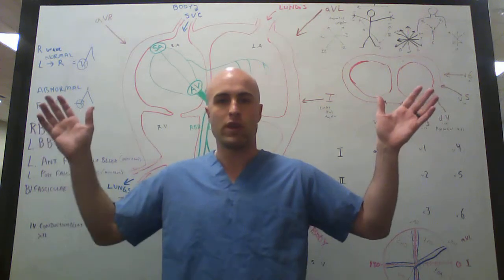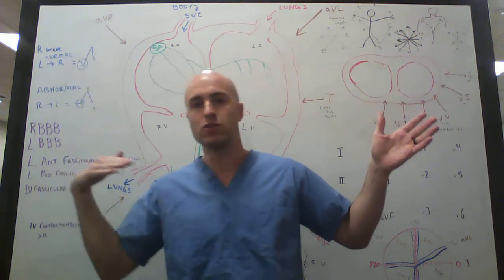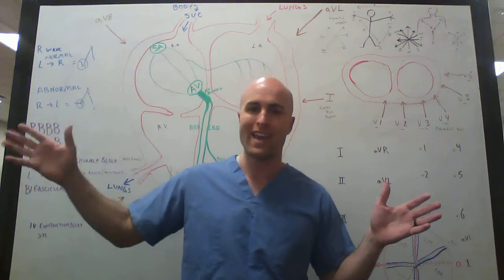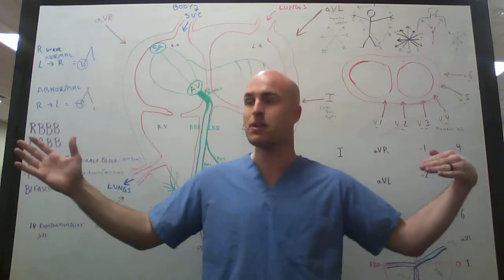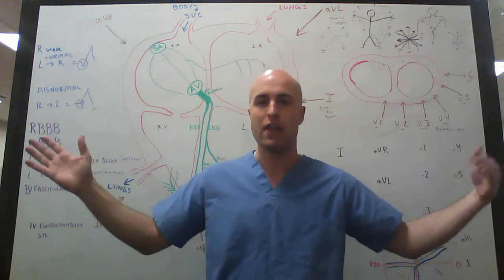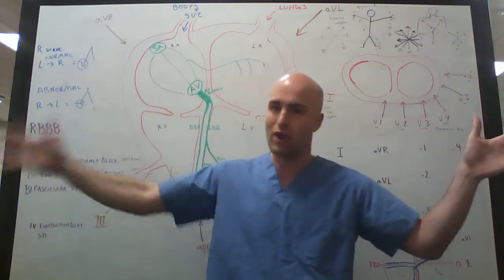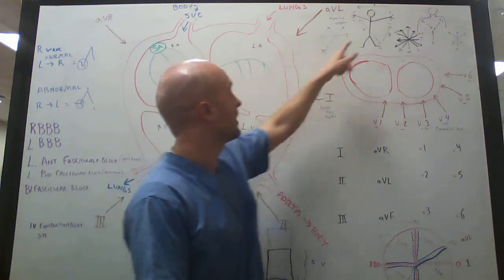Okay? In this case, you always think of the detection going from positive to negative. The right hand is always negative, always. So the reading is always going to go this way, towards the right hand. The first one is going to go from the left hand, which is positive, on top, to the right hand, which is negative. Positive on the left, always negative right hand. That's lead 1. I drew it up here, lead 1.